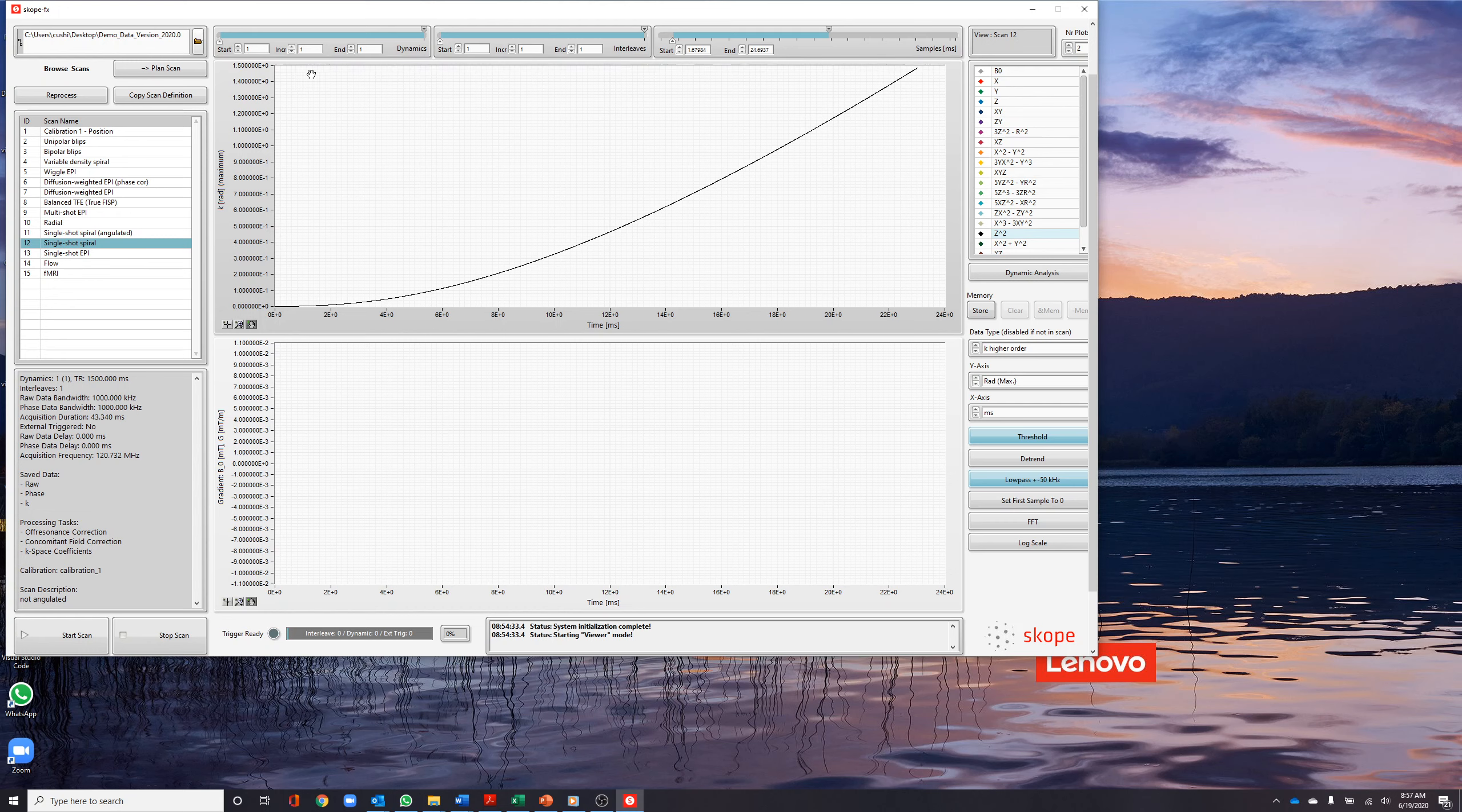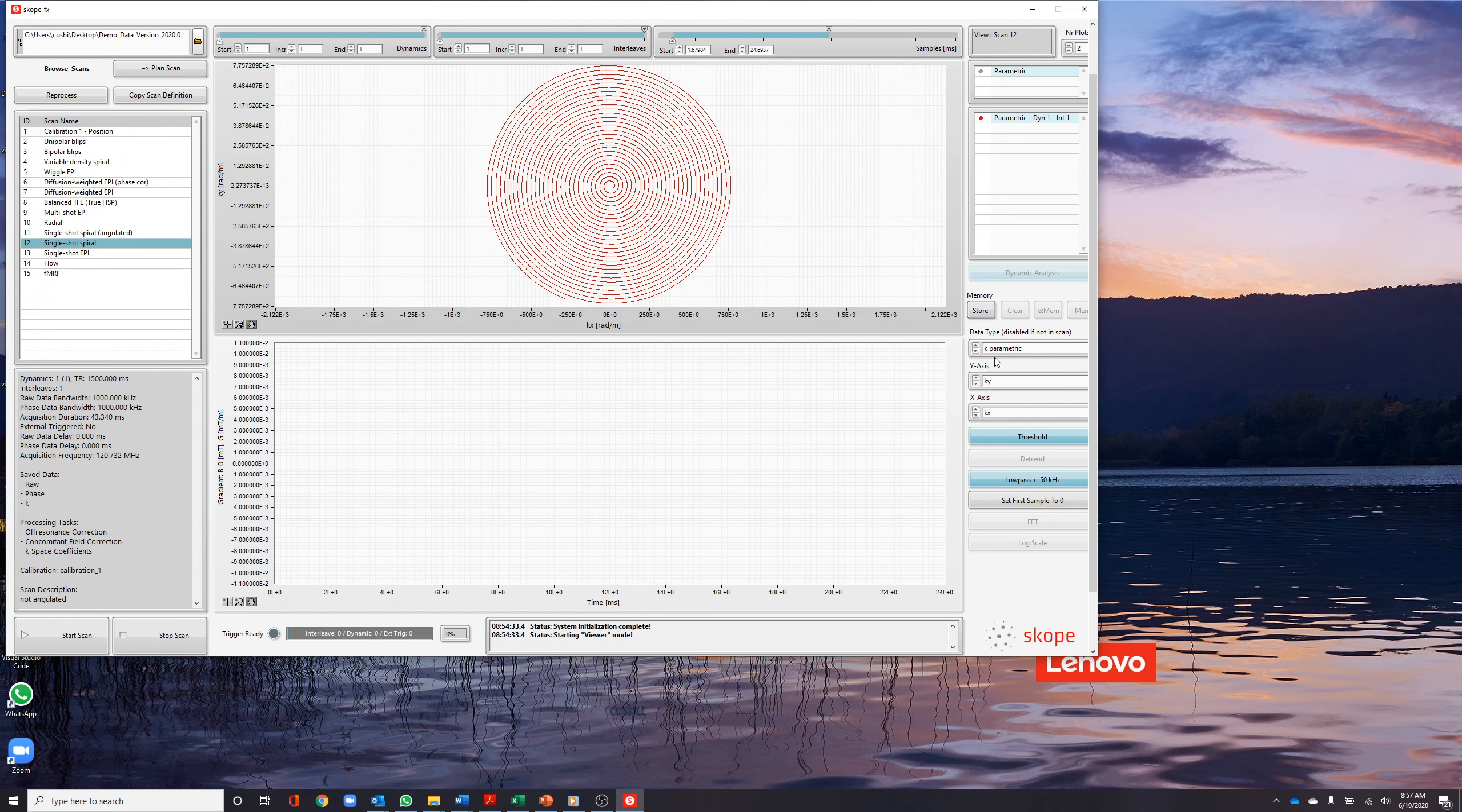The k-parametric option shows the measured k-space trajectory of the scan. Finally, there is the option to visualize the g-strength.